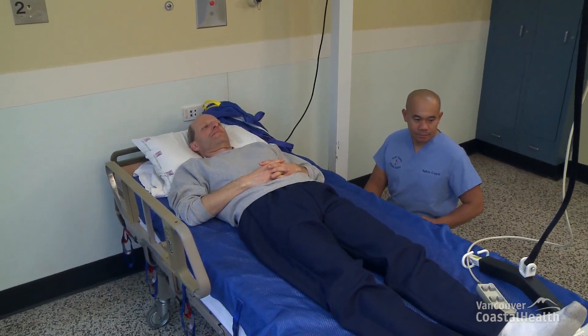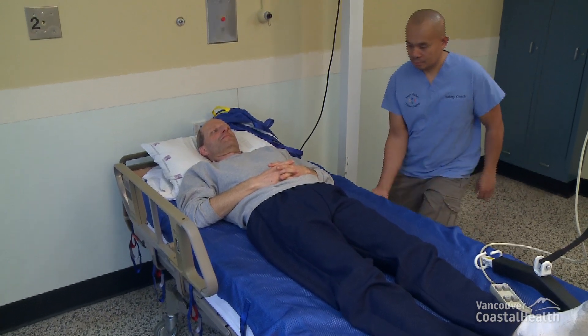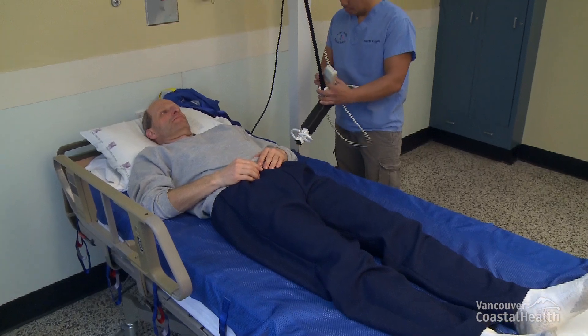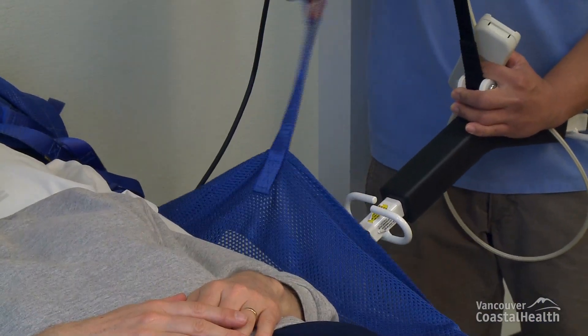Raise the height of the bed to a comfortable working height. If the bed rails are up, lower the bed rails on one side and connect the positioning sling strap on this side at the resident's upper chest, shoulder level.